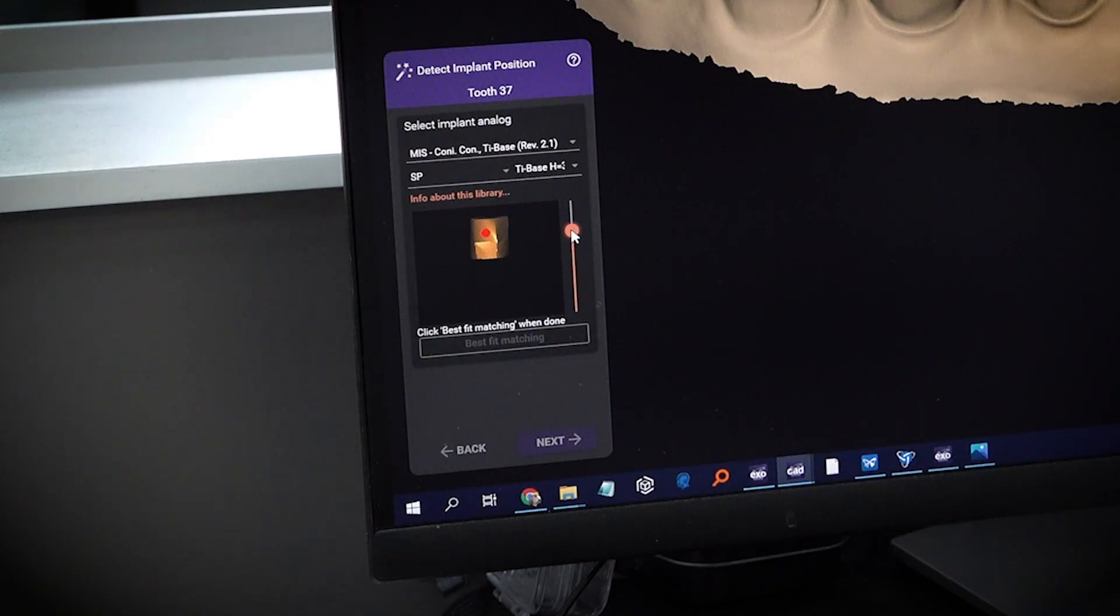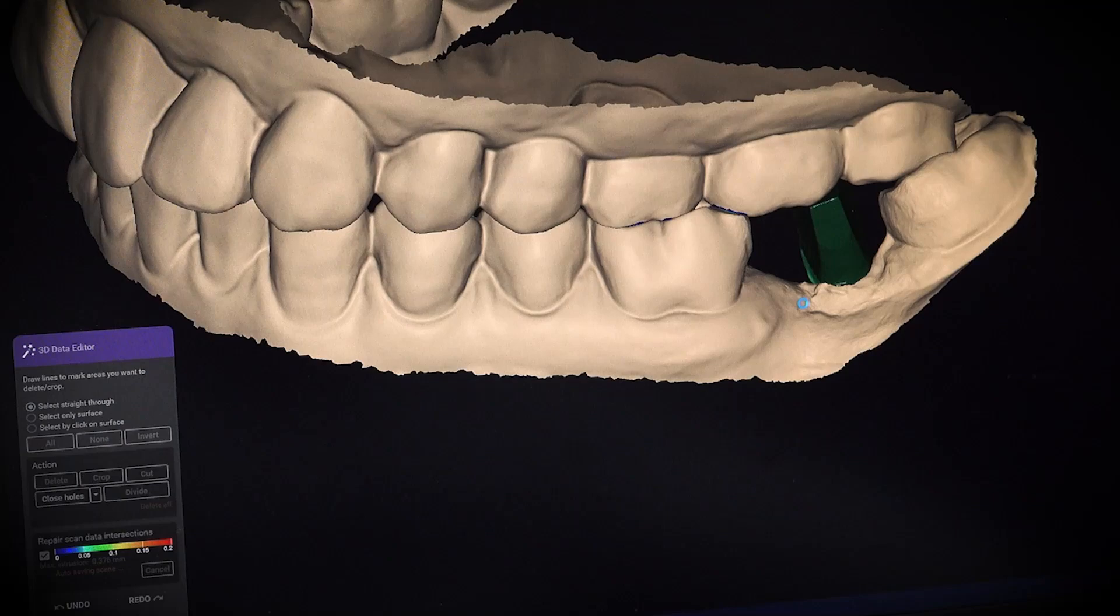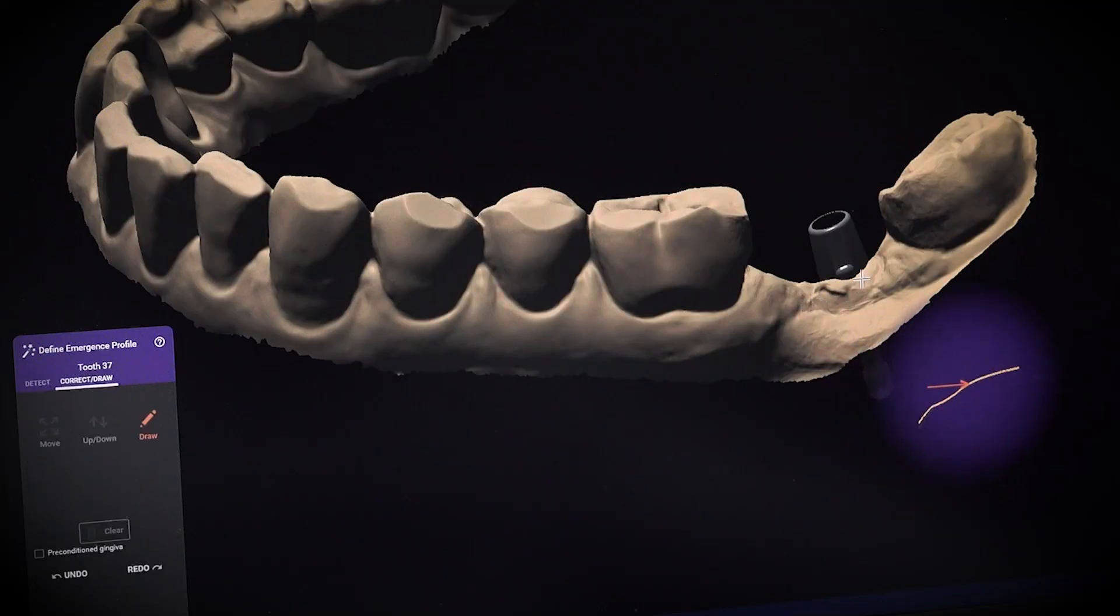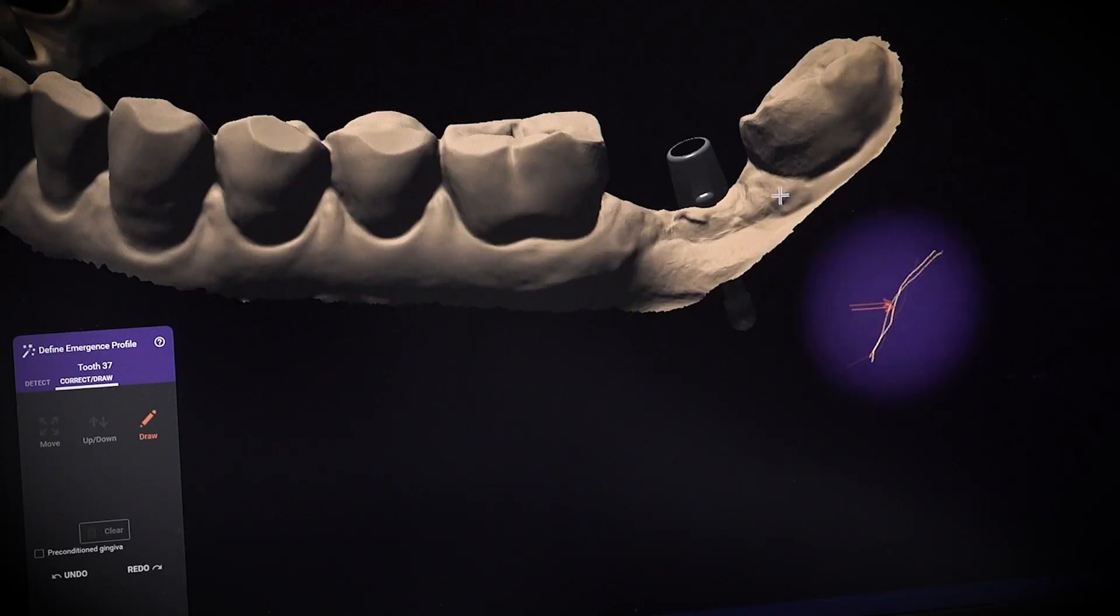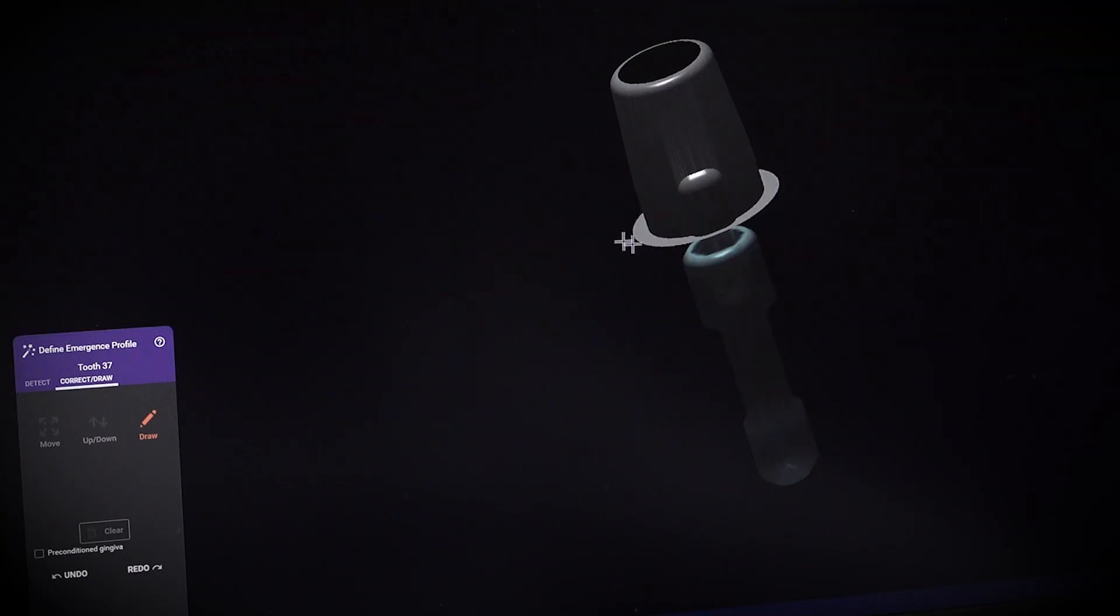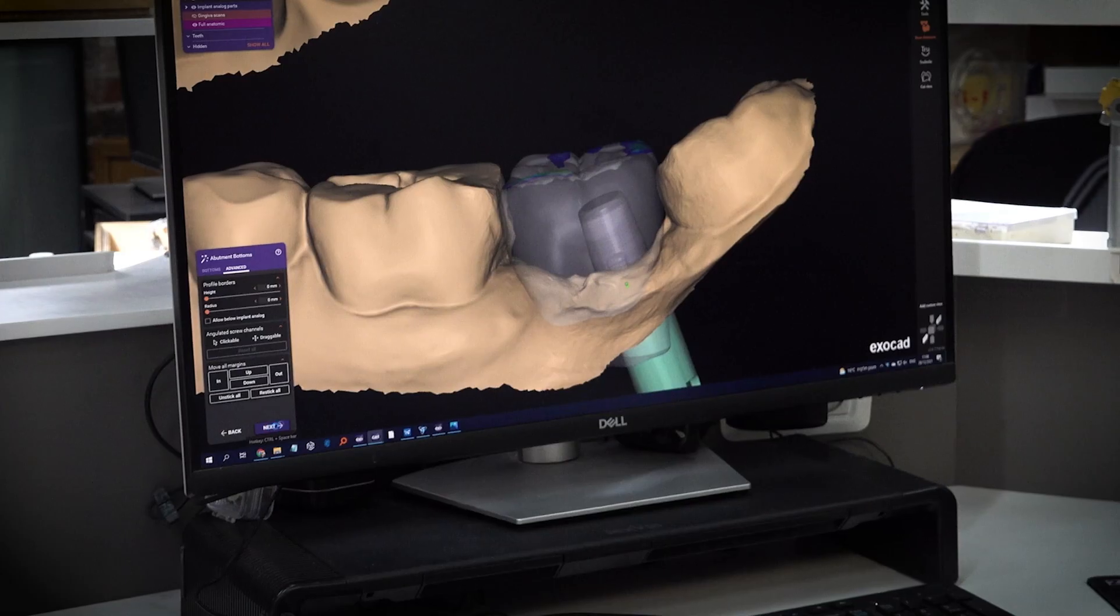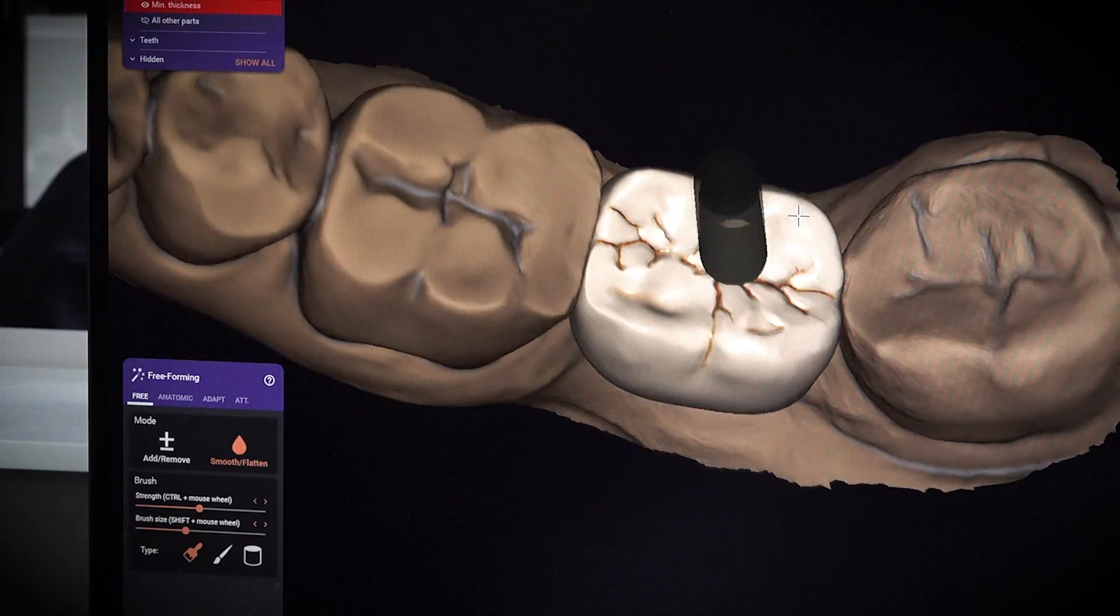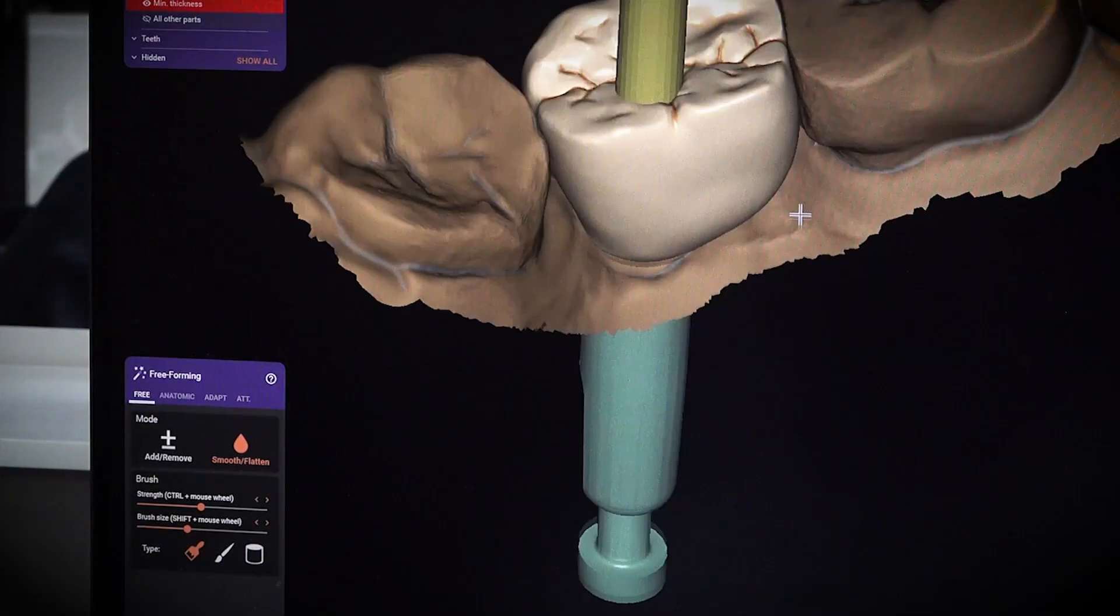Align the scan post in the scan file to the tie base frame shown in the library. The software will automatically perform the best alignment. Once the match is approved, the chosen tie base shell will be shown on the exact position of the scan post. Now we can start the design of the crown.